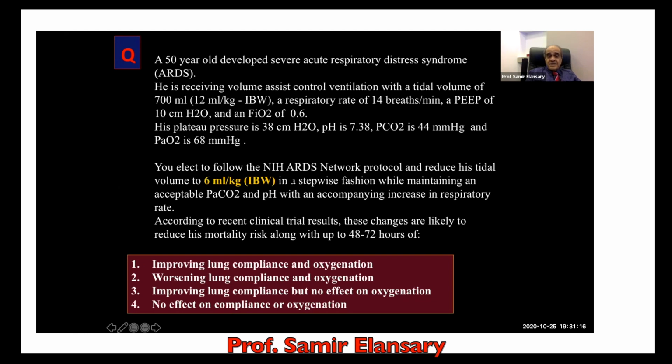You elected to follow the ARDS network protocol and reduce his tidal volume to 6 ml per kg ideal body weight in a stepwise fashion while maintaining an acceptable arterial CO2 and pH with an accompanying increase in respiratory rate. According to recent clinical trial results, these changes, which you make after decreasing the tidal volume to 6 ml per kg, which is the protocol for protective lung, are likely to reduce his mortality risk along with up to 48, 72 hours of: improving lung compliance and oxygenation, worsening lung compliance and oxygenation, improving lung compliance but no effect on oxygenation, no effect on compliance or oxygenation.